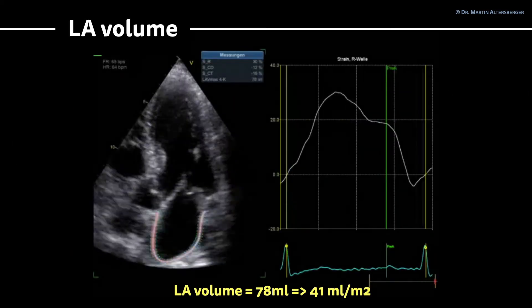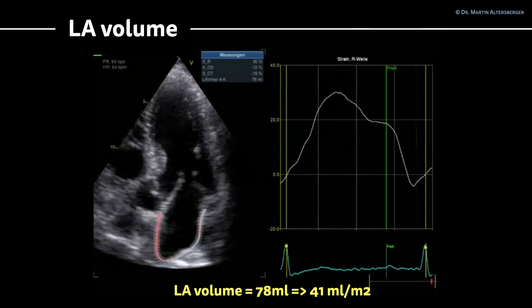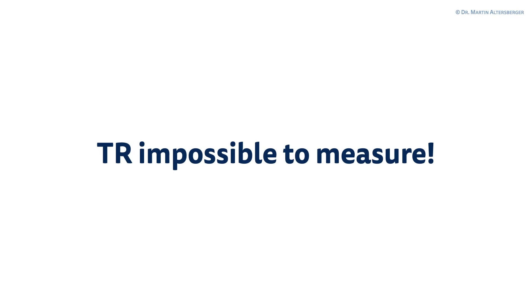Now let us look at the left atrium. As already visible in the smaller loops, the left atrium is definitely enlarged — a left atrium volume of 78 milliliters, equaling 41 milliliters per square meter in this patient, so it is definitely an enlarged left atrium. We have one negative criterion — the E to E prime ratio — but one positive criterion — the volumetric index. TR was simply not possible to measure in this patient.